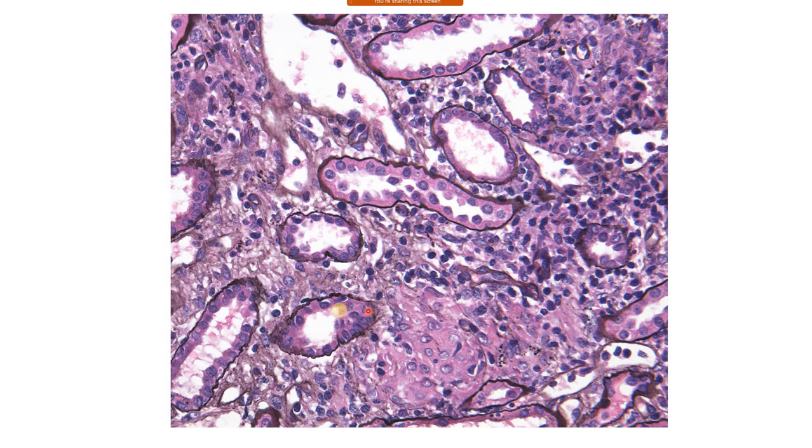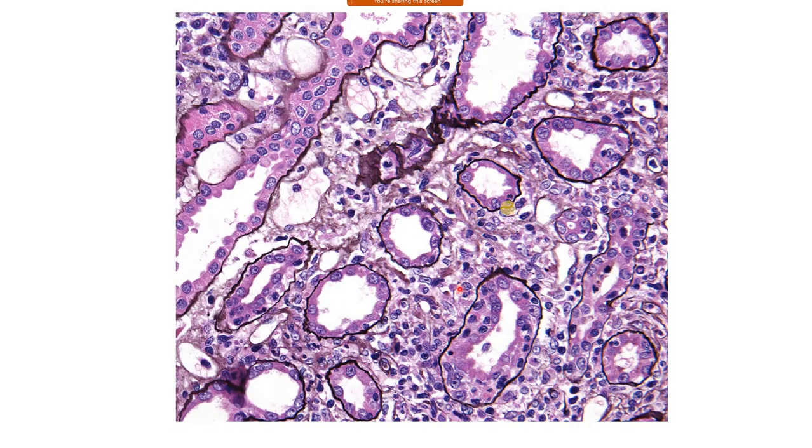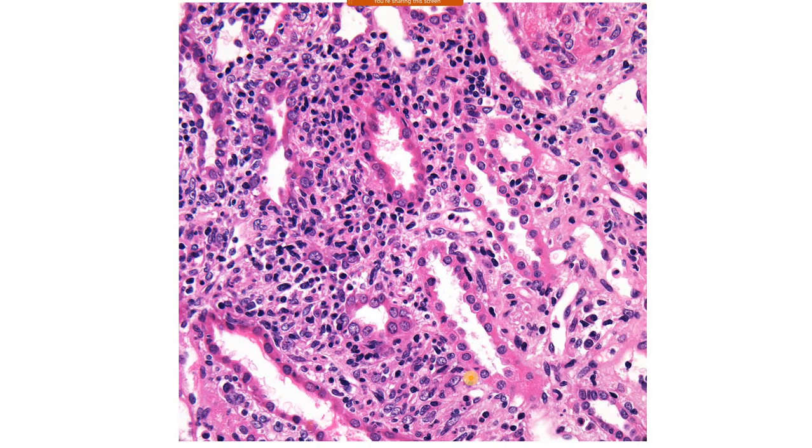You see the lymphocyte here, and here as well. So this is tubulitis. And also this area is granuloma without necrosis, with inflammation here. And this is the edema. This area shows more prominent edema in the interstitium, a little bit of inflammatory cells and lymphocytes, and also plasma cells here and tubulitis here. This is H&E staining. You see the severe interstitial inflammation again and also tubulitis.